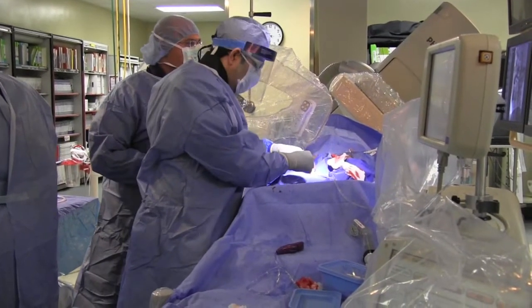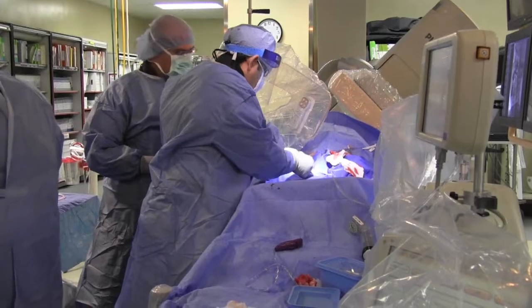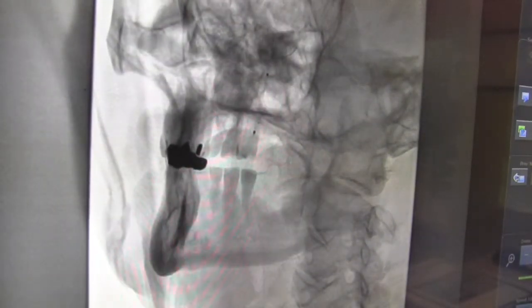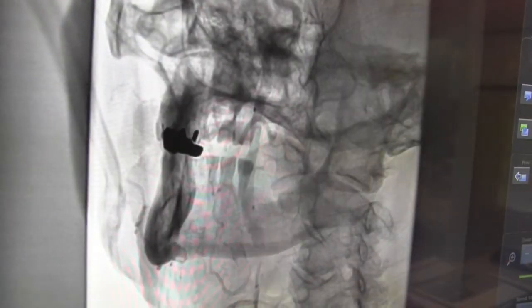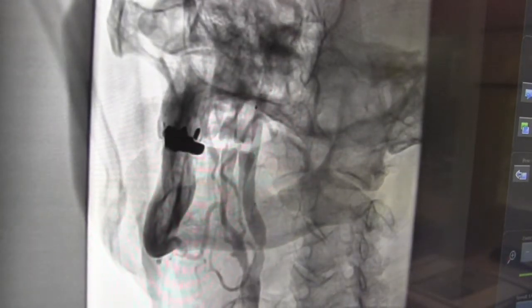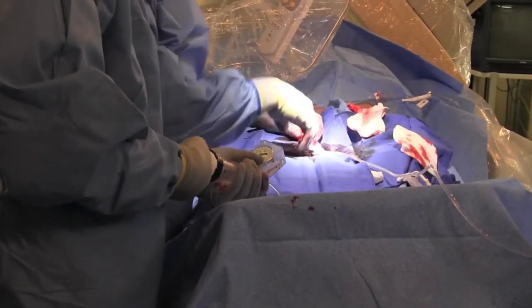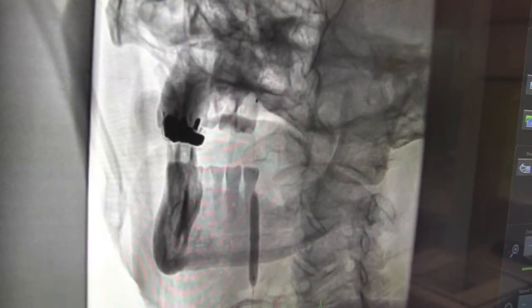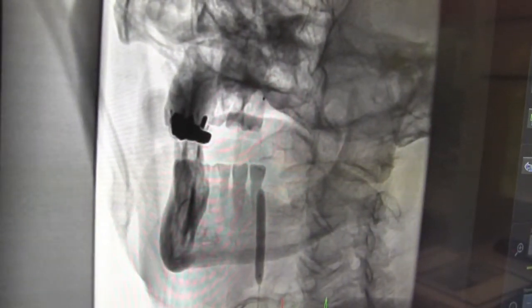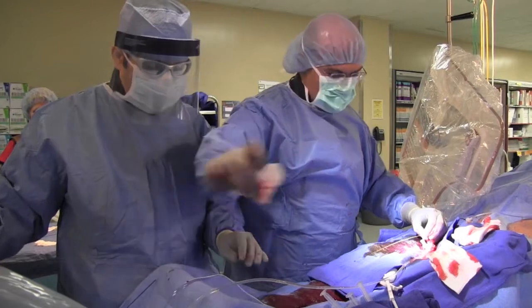Here we're advancing our balloon catheter, which is positioned between the two markers climbing up the wire. We're confirming the location of the balloon to be centered around the blockage of concern. Here we're inflating our balloon to pre-dilate that blockage and stretch open the plaque. Here we're withdrawing our balloon catheter.